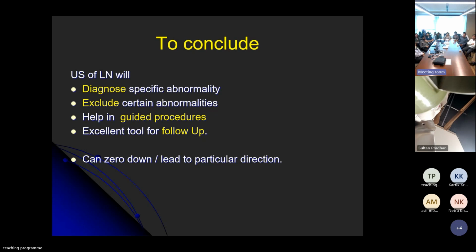Is there a concept like TIRADS or PIRADS in the determination of lymph nodes? Is there a useful system? Nothing has been devised for nodes as such, because it is just multiple parameters put together, and then we tend to see. Some of the nodes look frankly metastatic, and there is no problem in those. Those which are borderline, we can have a problem. So in fact, we tend to use that indeterminate word a little more commonly than anyone would like. We want to reduce that percentage by saying we would be doing FNAC.